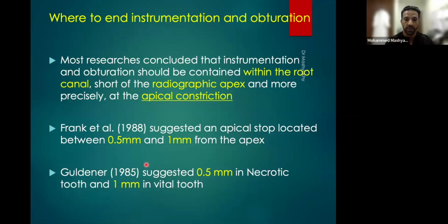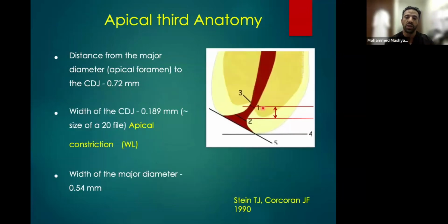Okay? So somehow, if you rely on this diagram, we would like to stop here, somewhere here, okay? Because all this area is filled with periodontal ligament. I don't want to go there. I want to just finish my obturation.